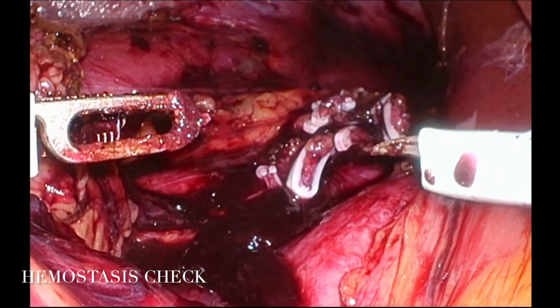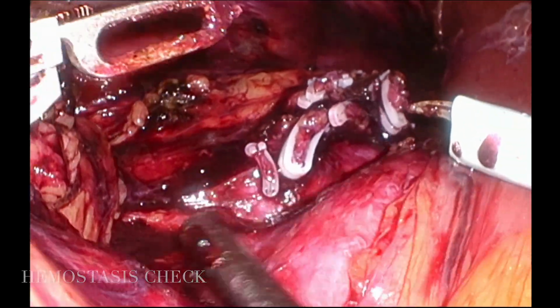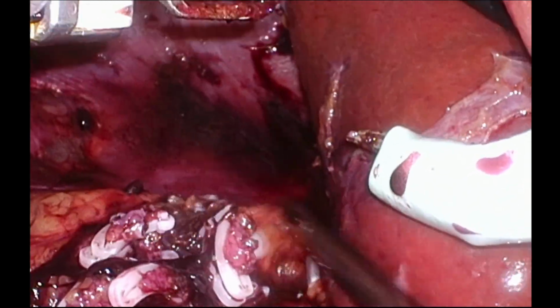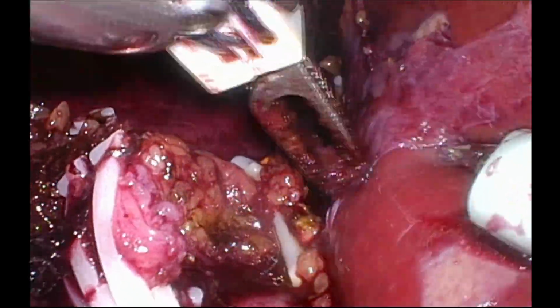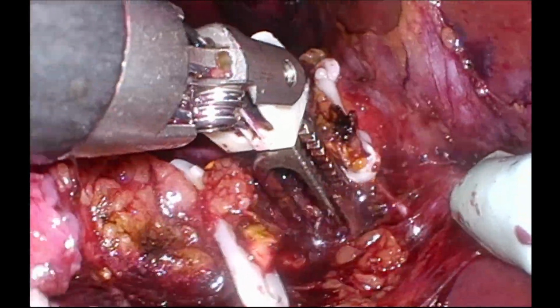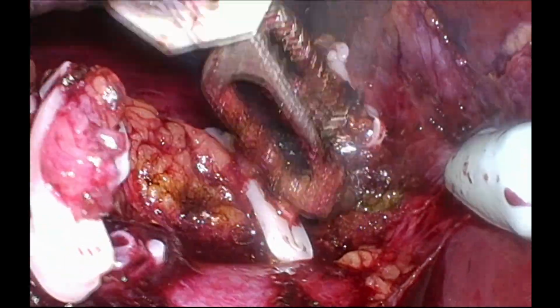After the completion of resection, any residual clot and blood are sucked out with laparoscopic suction cannula. The resection field is irrigated and hemostasis is secured.